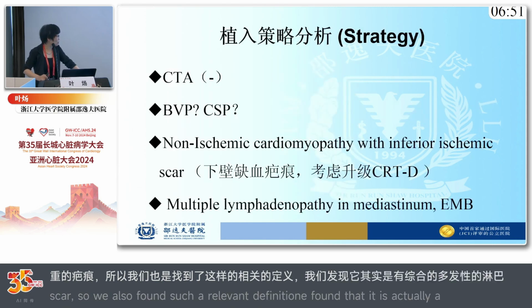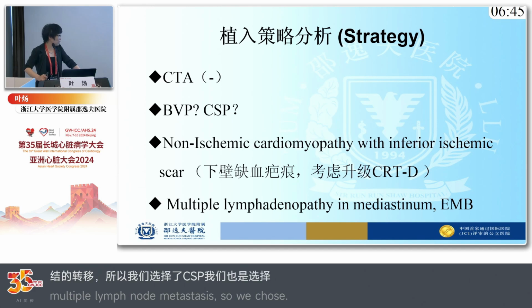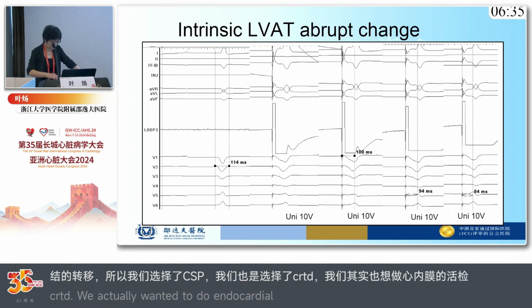So we chose CSP, and also we chose CRTD. And we would like to do something special. We wanted to do an endomyocardial biopsy at that time during the implantation. And the implantation was very successful.